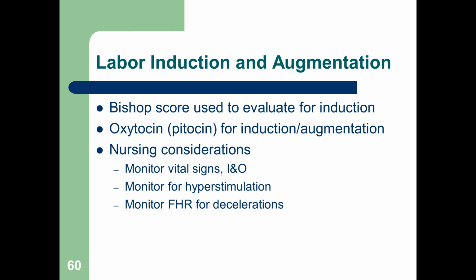Nursing considerations, certainly if you're inducing labor or augmenting labor. You're going to monitor vital signs, intake and output. You're going to monitor for hyperstimulation. If you're using Pitocin, certainly you will be. You don't want to overstimulate the uterus because that can lead to rupture and distress. Okay? Monitor the fetal heart rate for decelerations.